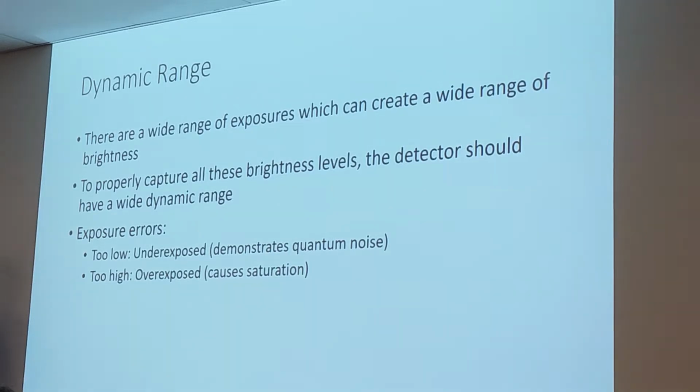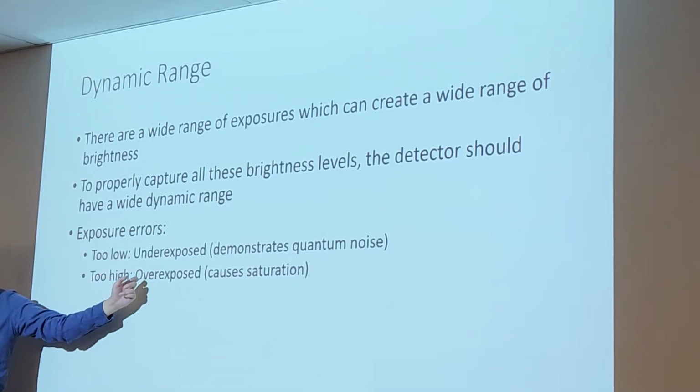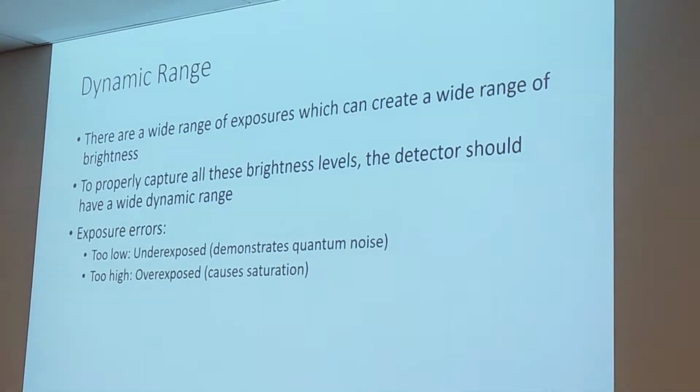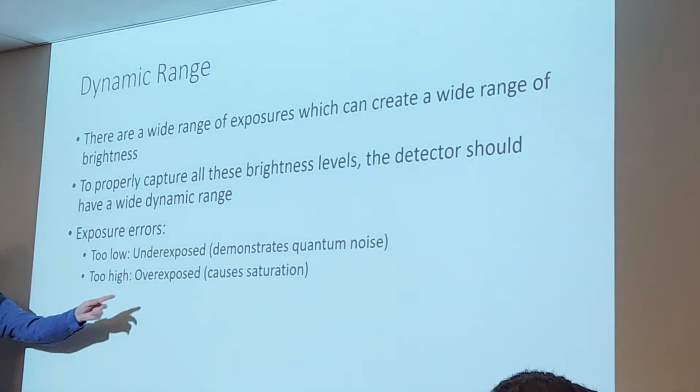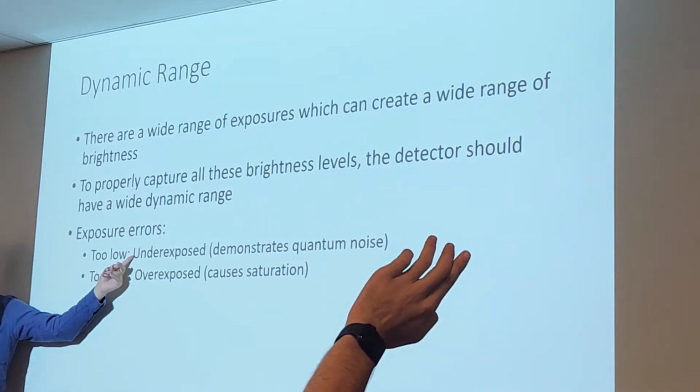Okay. So, if our exposure is too low, if we do not have enough X-rays, we call that underexposed. Low, under, so underexposed. Too high, we call it overexposed. High, over. So overexposed, how does that image look? Black. Underexposed, how does that image look? White. So too many X-rays, image looks too black, overexposed. Too few X-rays, not enough, looks white.